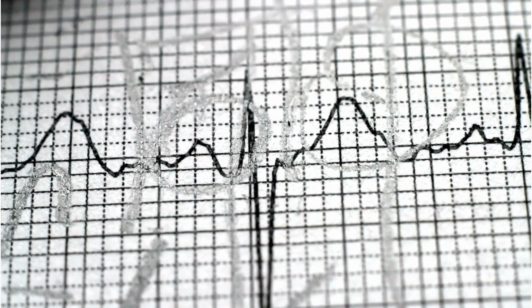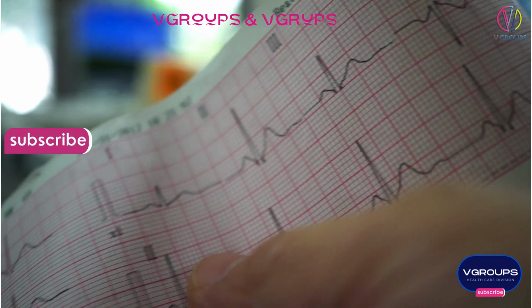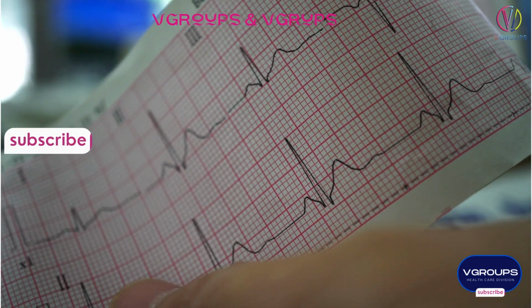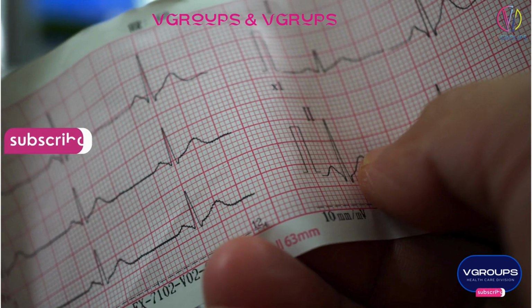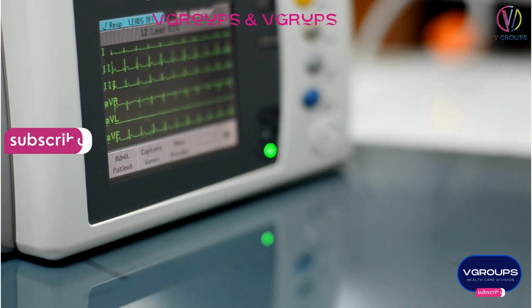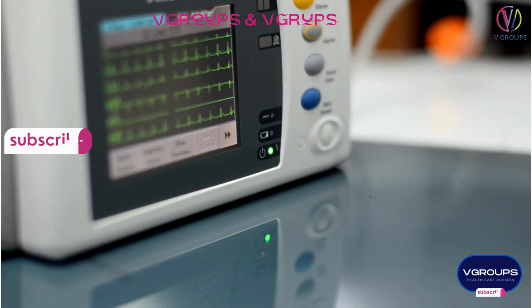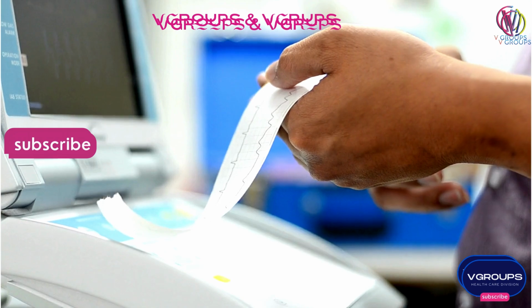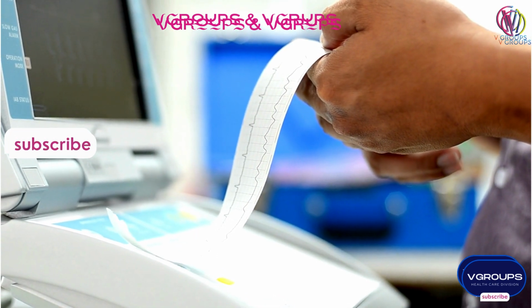Storage and retrieval. The ECG machine can store the recorded ECG data for future reference or comparison. This is especially useful for monitoring changes in a patient's heart activity over time. Printout. Communication. Some ECG machines have the capability to transmit data electronically to other healthcare systems, facilitating remote monitoring and consultation. Overall, the ECG machine plays a crucial role in diagnosing and monitoring various cardiac conditions by providing a visual representation of the heart's electrical activity.